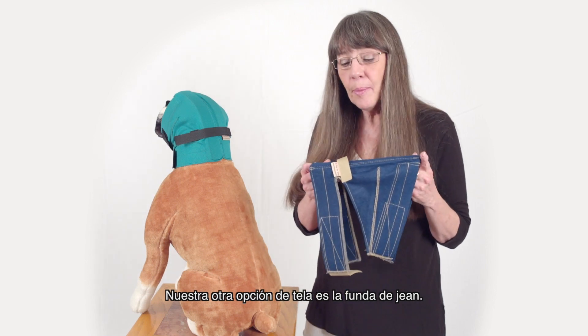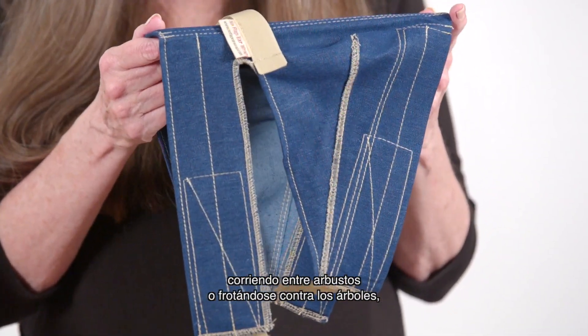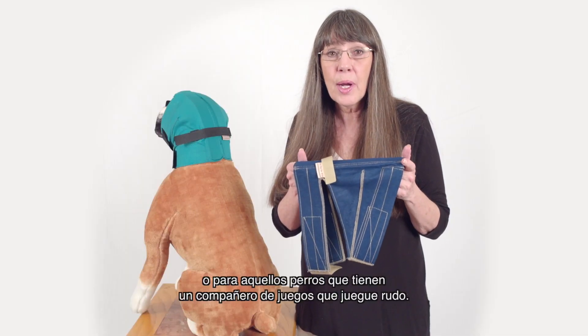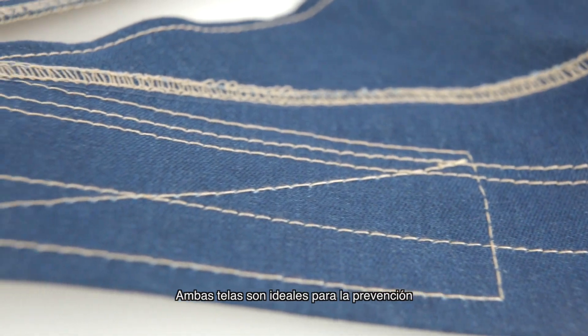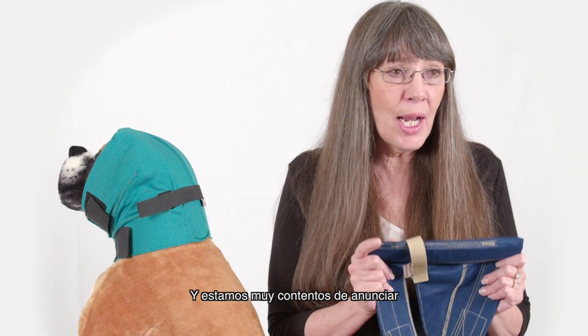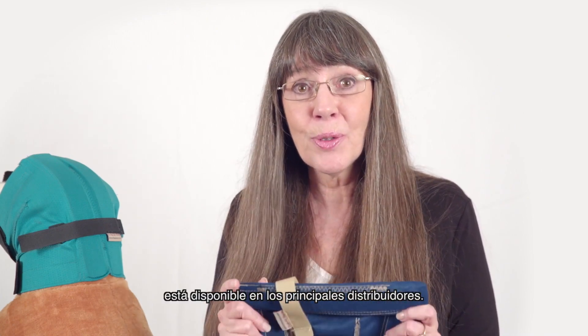reattach the wrap and that way the dog cannot shake the medicine all over the bathroom walls. Our other fabric option is our denim wrap. This is great for dogs that spend a lot of time outdoors running through bushes, rubbing up against trees, or if they've got a playmate that plays rough. Both fabrics are great for the prevention of cheatgrass and foxtail, and we are excited to announce that No Flap Ear Wrap is now available through all major distributors.